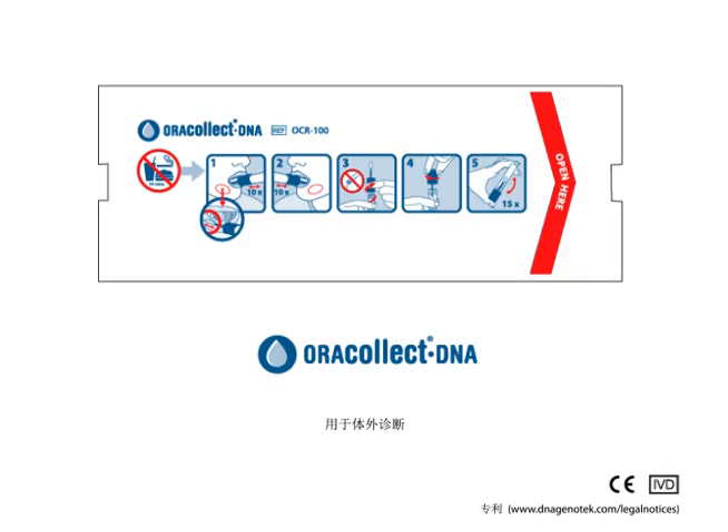ORAcollect DNA is designed for the self-collection and stabilization of DNA from human oral samples. Each ORAcollect DNA packaging contains one collection kit for single use.